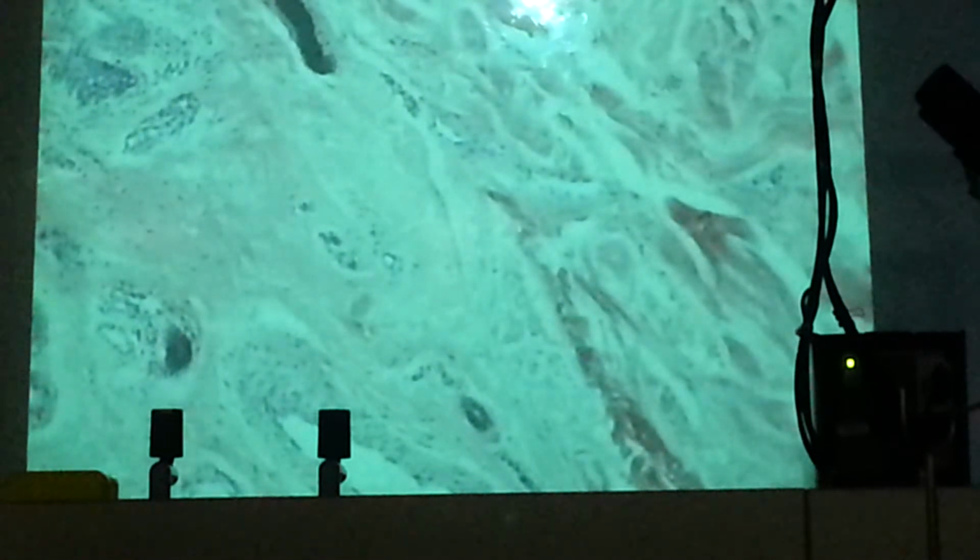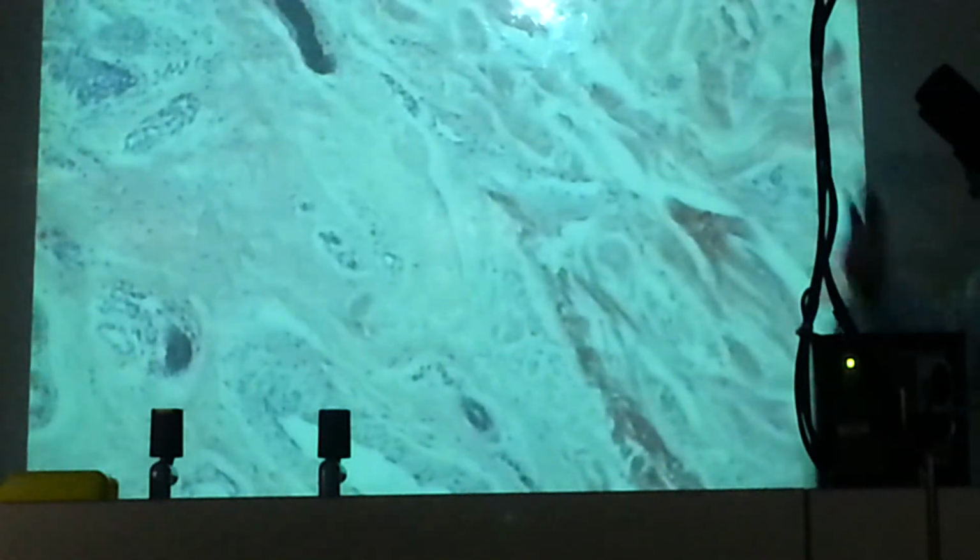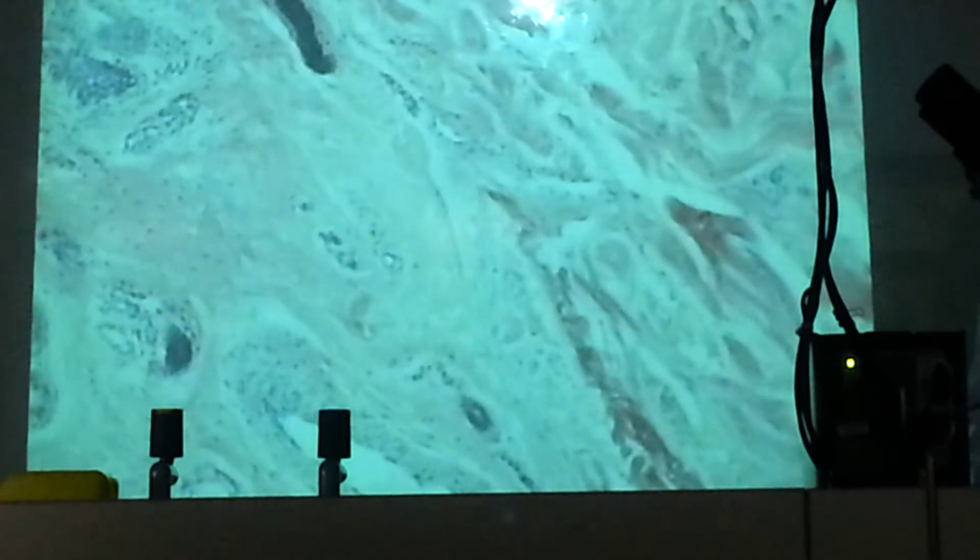Okay. What is this type of section? Connective tissue. Which type of connective tissue? Irregular. Is it dense or non-dense? Dense. So what is the type of section here? Dense irregular connective tissue. Why? Rich in collagen bundles or fibers, and the fibers run in different directions. One more time, the type of tissue: dense irregular connective tissue.